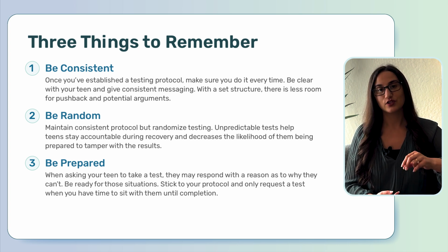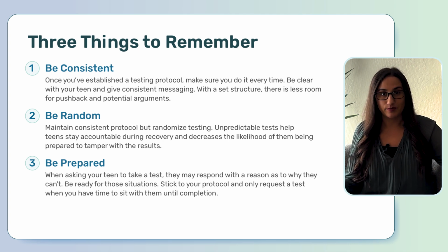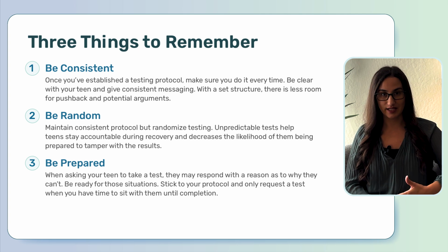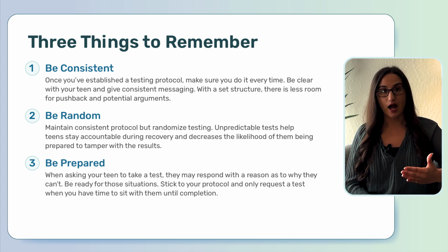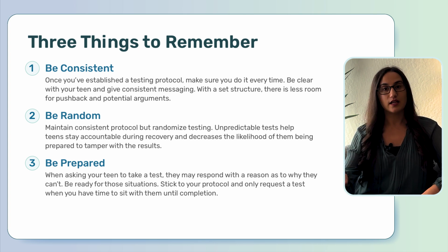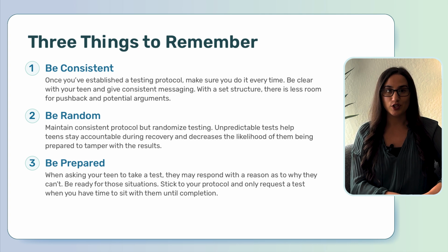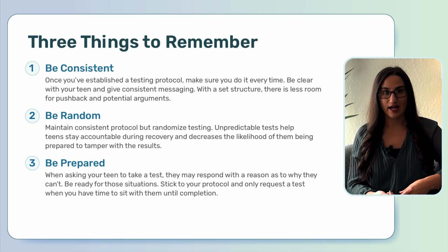So let's say your teen says, well, I don't have to pee. I don't have to go to the bathroom. That might be true. But once we ask them to take that test, it's really important that we stay with them until they take that test. So a way that you as a parent might respond could be, I understand, I hear that. Let's go get you a glass of water. And then we can sit and watch TV until you do have to go. Or I'm just here in the kitchen, so why don't you sit at the table and you can work on some homework and let me know when you do have to go. So that's a way that we can be prepared in the moment on how to respond.